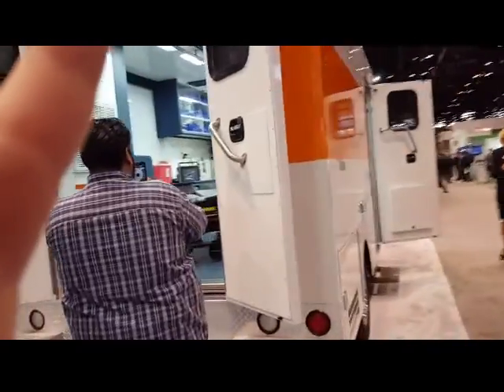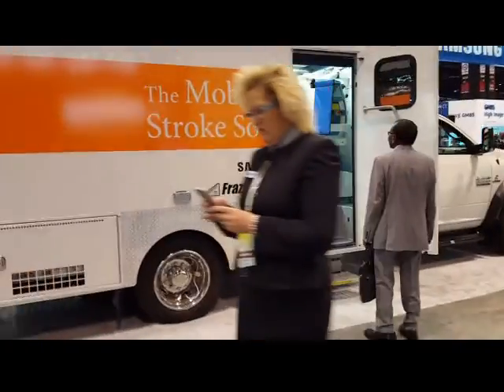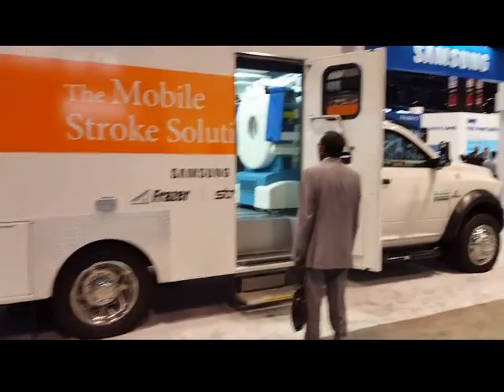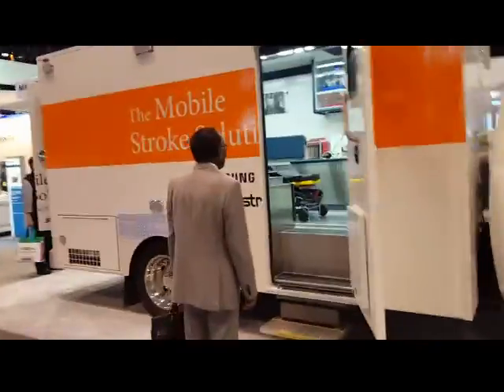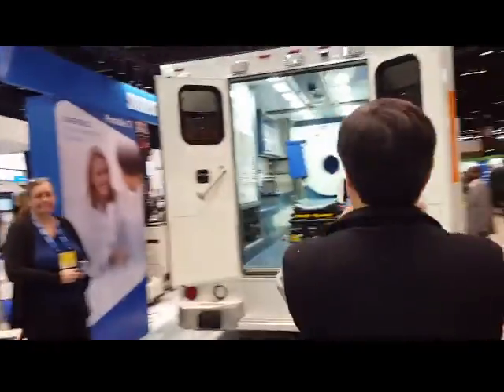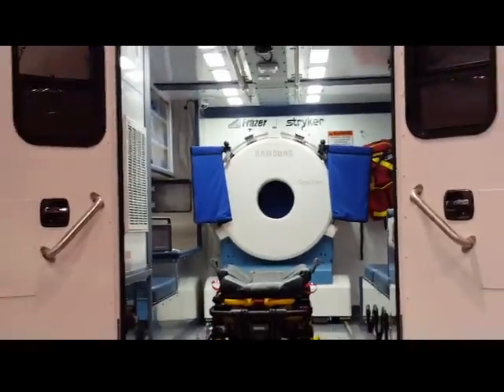I thought it was an ambulance, and it kind of is, I guess. Mobile stroke solution — I guess you can do CTs inside there while you're taking the patient to the hospital? I don't know. It's kind of weird, but kind of cool. And there is a scanner in there — I'll show you guys.